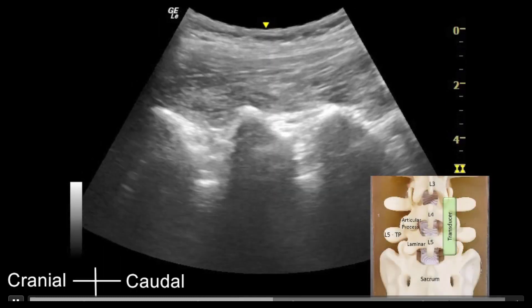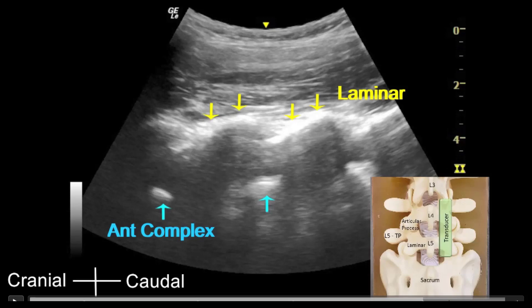From this point, the transducer is slid medially along the same level and in the same orientation until the articular processes are seen. The 'camel hump sign' denotes the sonographic features of the articular processes that appear as one continuous hyperechoic wavy line resembling multiple rounded camel humps. This is the paramedian sagittal articular process view. With the transducer at the same location, it is now tilted slightly towards the midline such that an image through the interlaminar space is obtained. In this view, the laminae are represented by hyperechoic structures that are discontinuous and slanted — these are conventionally described as 'saw-tooth'.